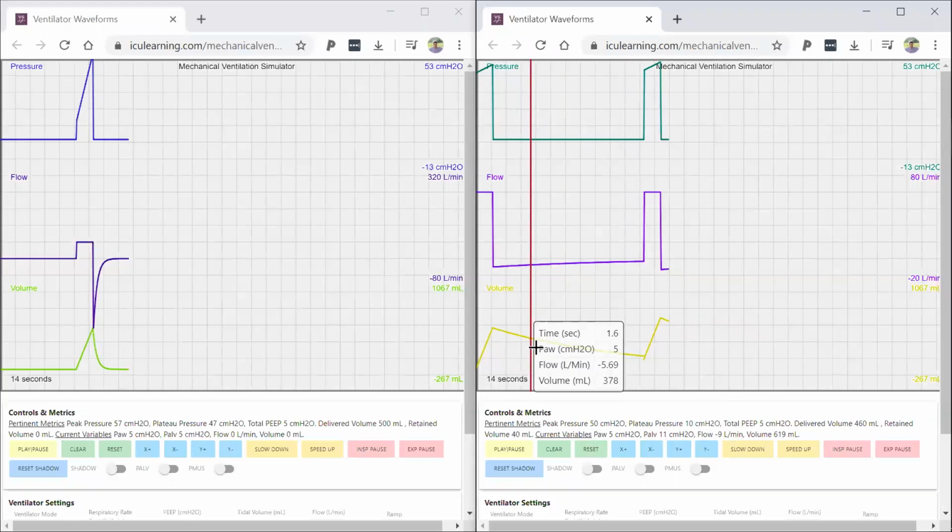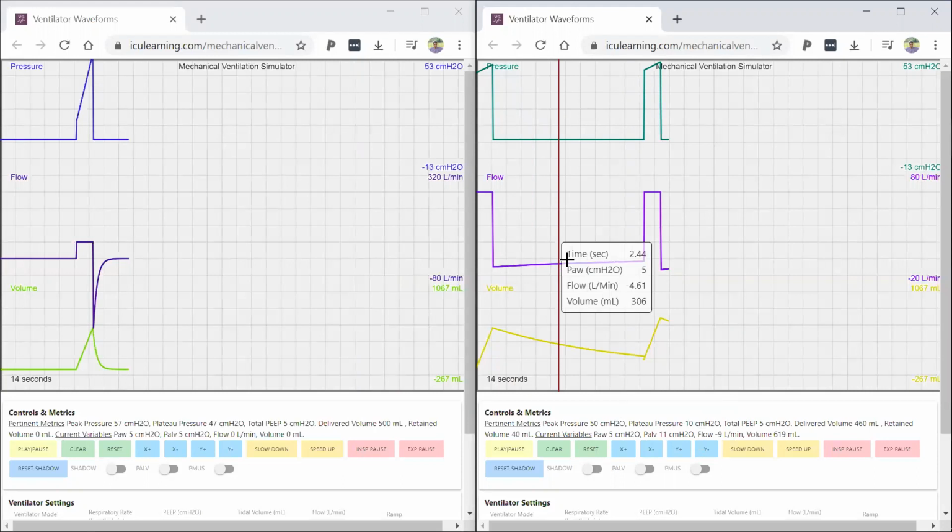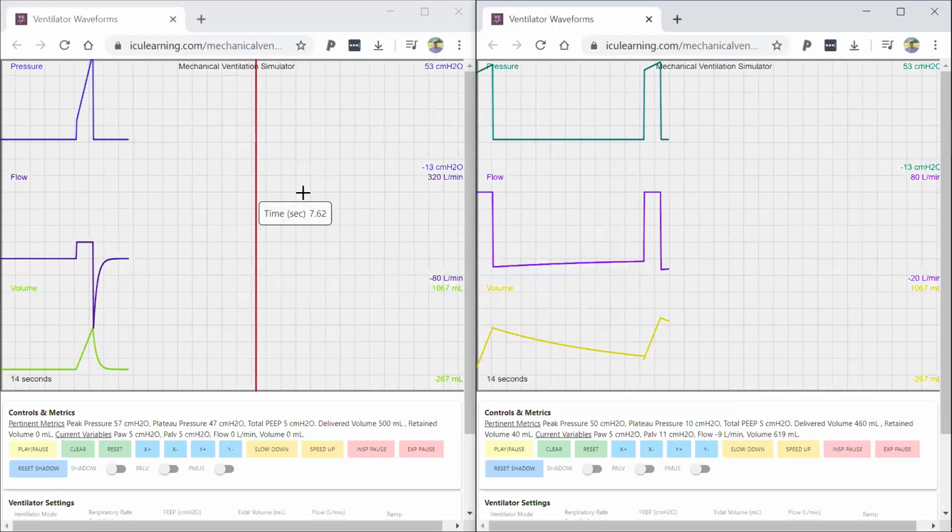So it's important to differentiate between the two cases in terms of diagnosis, and also the treatment is obviously going to be different between the two cases. One thing you can do to differentiate the two cases is to do a plateau pressure. Remember, checking a plateau pressure is going to give you an assessment of the alveolar pressure.